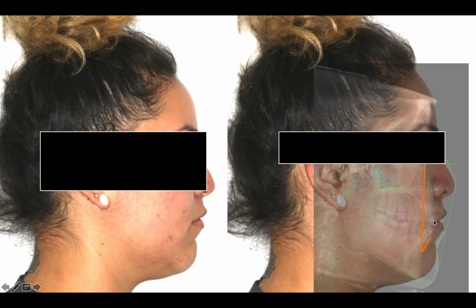And so what the plan was, since we were doing the bilateral canine substitution, we knew that we were going to move all the maxillary teeth forward, and then by taking advantage of pulling the first premolars, we're going to move and upright the lower teeth. By doing that, we were going to get that really nice class 1. That's why the bilateral canine substitution worked, because we needed to reduce space anyway to get the patient out of the class 3 or edge-to-edge occlusion.